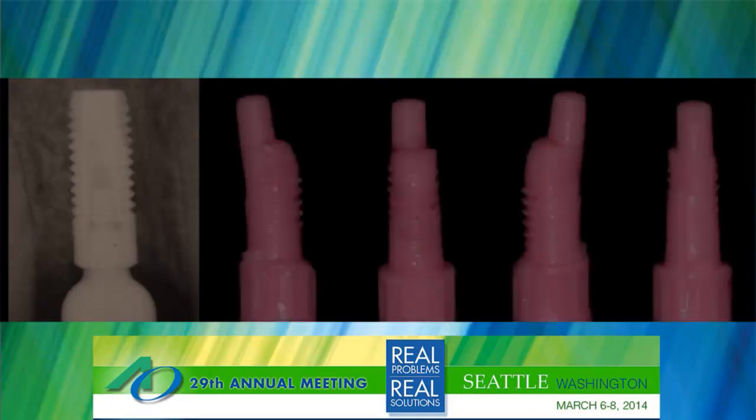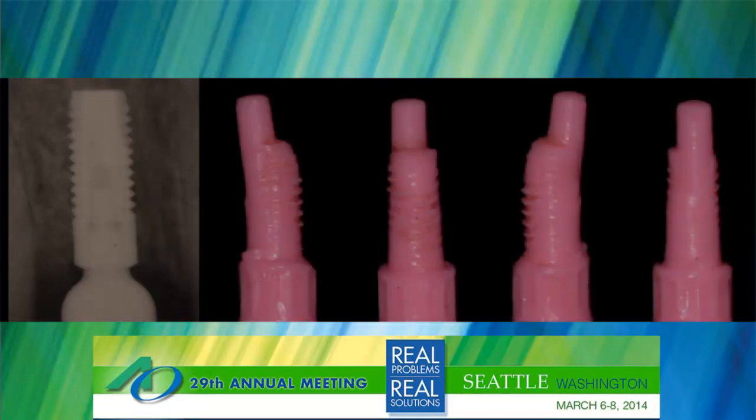Okay, I want to show you one of the cases that came out of Canada. This was out of Montreal. This was a case that a prosthodontist in Montreal sent to me to take a look at to see what could be done. It's fractured, and they've already gotten the screw out, but here's the impression I had her send me, and I photographed it every 90 degrees.